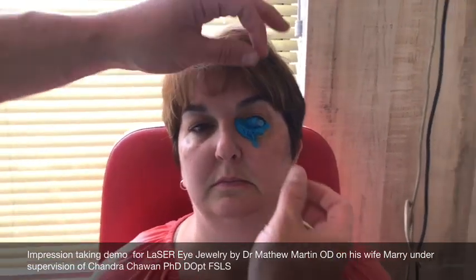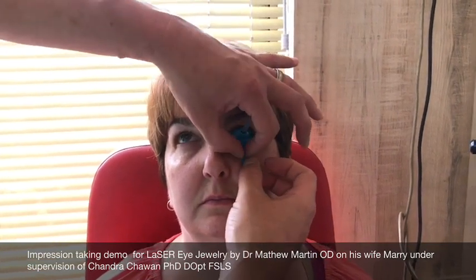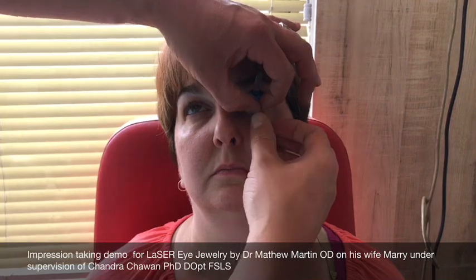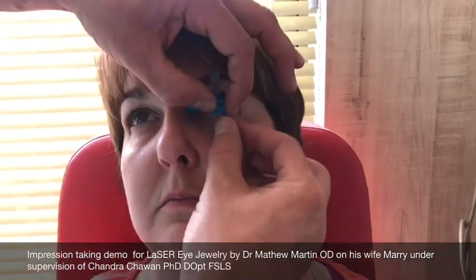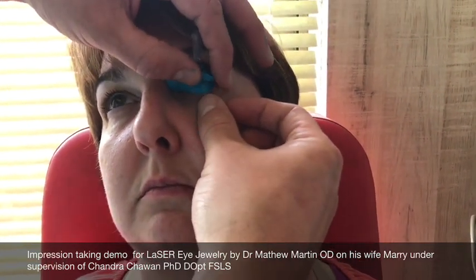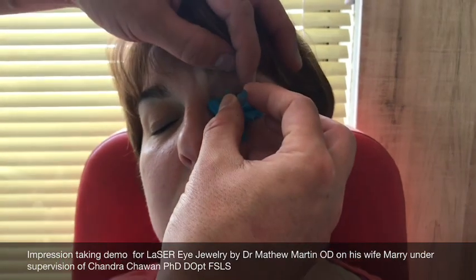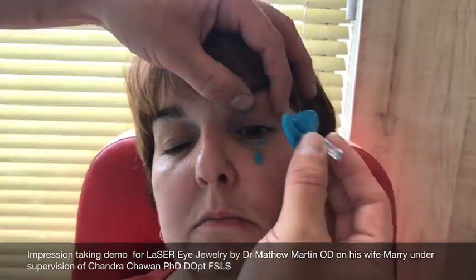So you can start working from the lower lid, release that silicone. Go ahead and look all the way up for me, slowly — release that silicone. Just going to tug on that silicone instead of skin, pull the silicone up — there we go. Working on that, breaking that loose — there's a little bit of a technique to this. Go ahead and look down for me. You can hear that sound — suction — and it's out. Just get the lashes out of the way, and there we are.